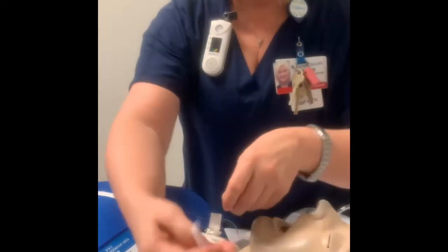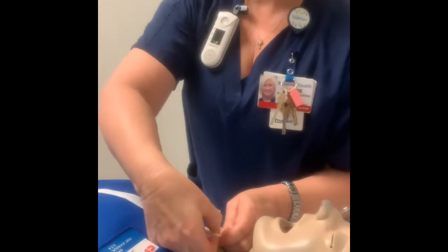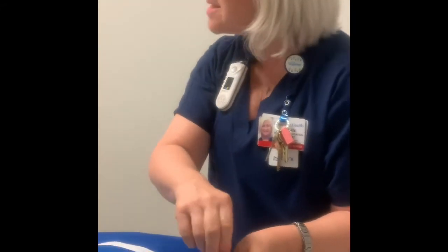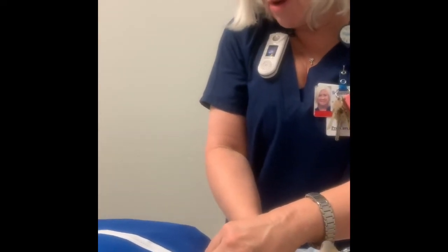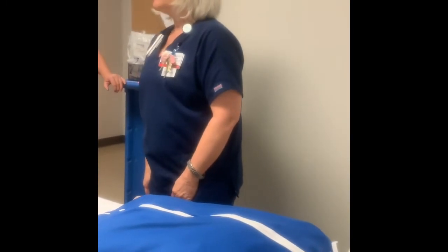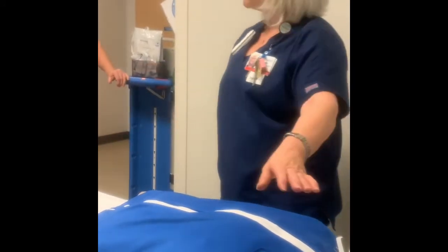Okay? So, now let's say my third altered airway. I have a partial laryngectomy. And they'll do that because maybe there's strictures, maybe cancer they've had to remove, but my larynx is still intact. I've got a partial laryngectomy, but my trach falls out. What am I gonna do? Where can I ventilate? You're recovering this patient. They have a trach tube in, but the trach falls out and they're a partial laryngectomy.